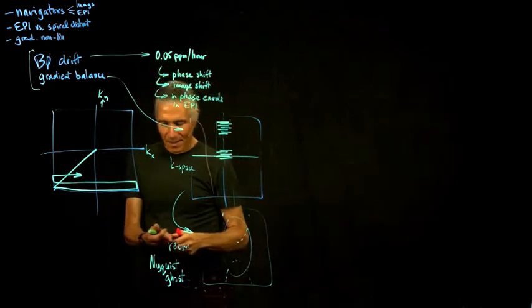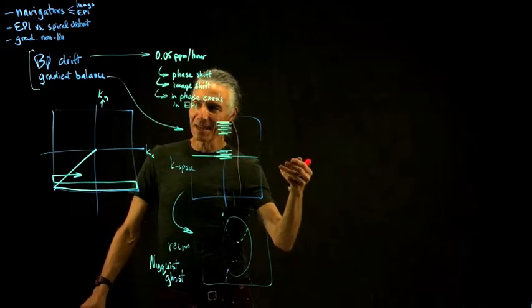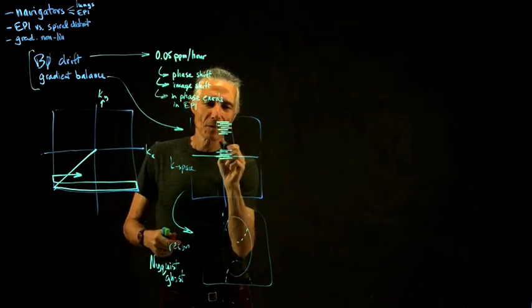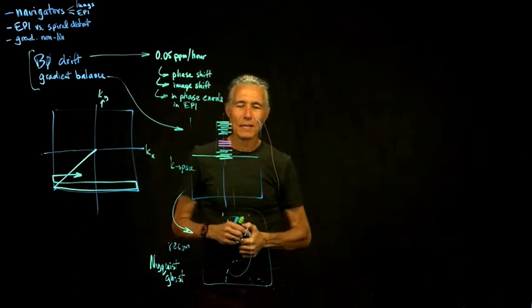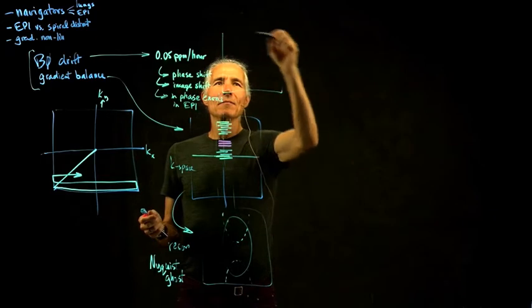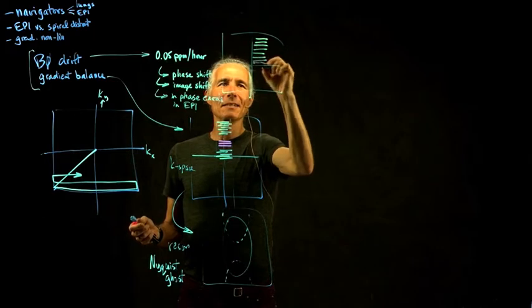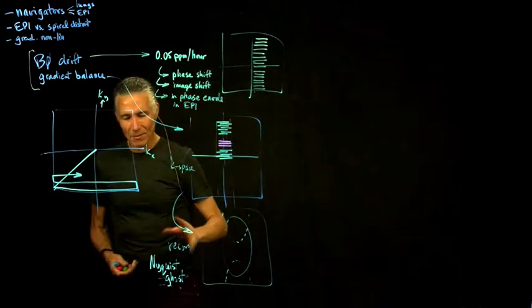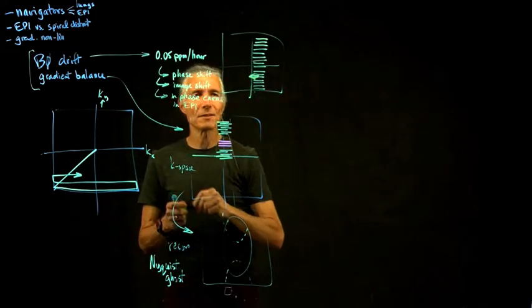And then we had some settings called tweakers. You would tweak the tweakers and collect another one until you got rid of that artifact, and ended up with the left and the right pass all perfectly lined up. What if the echoes came back over here, like that? That turns out to be a Fourier frequency shift error. It doesn't cause too much trouble, but you might want to move those echoes to where they're supposed to be, centered.